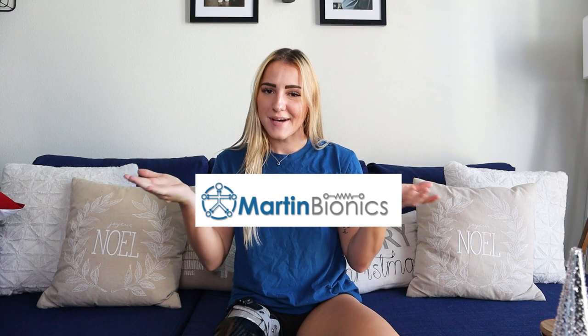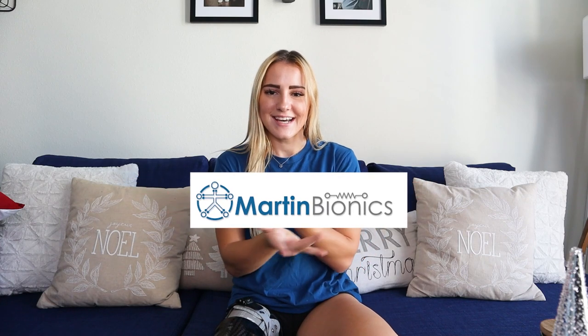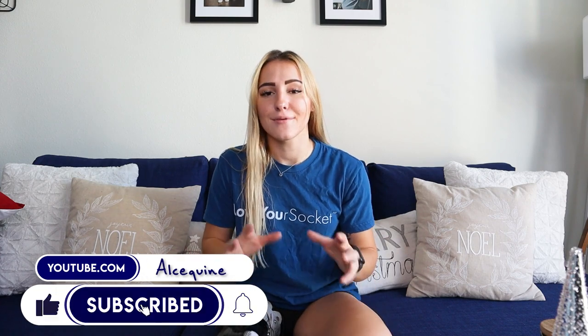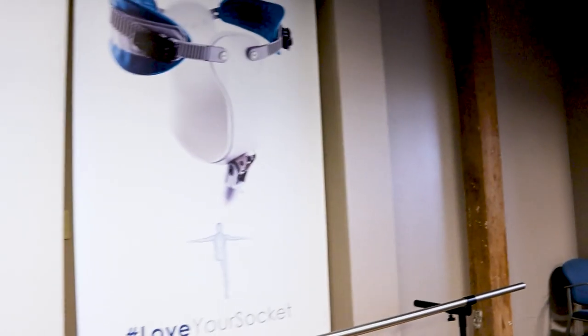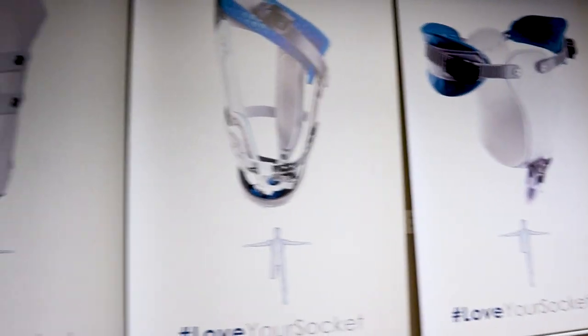Today's video is all about Martin Bionics. As you all know, I'm an amputee. I've been an amputee my entire life and I recently just got connected with Martin Bionics because they have come up with a brand new socket.